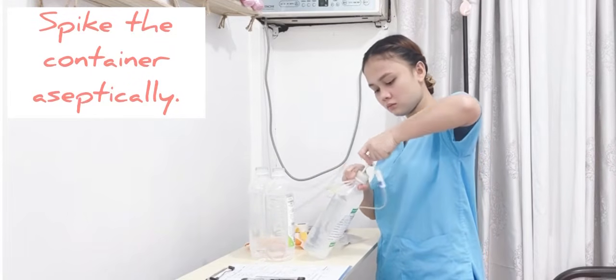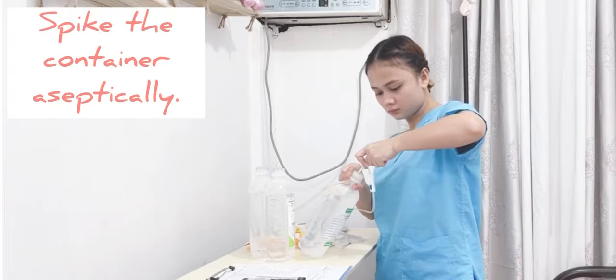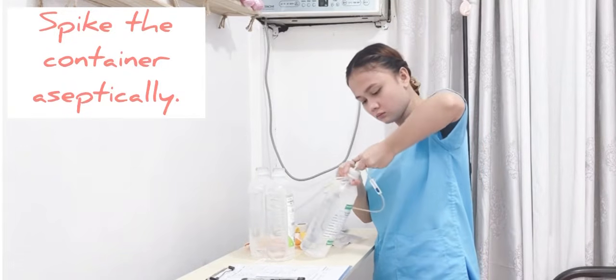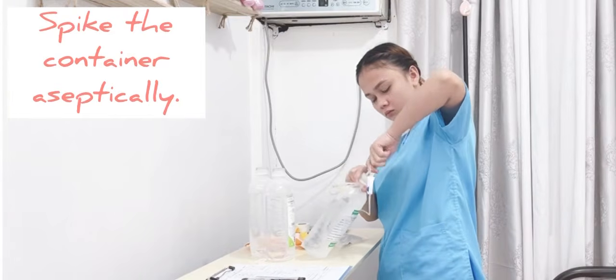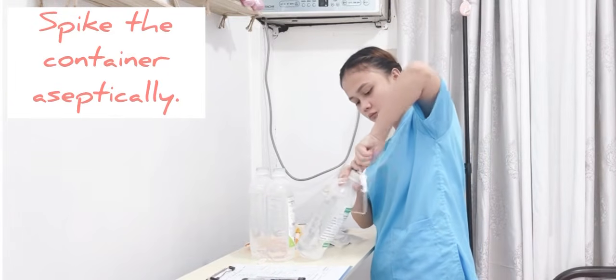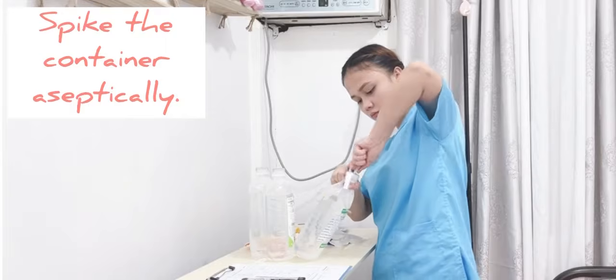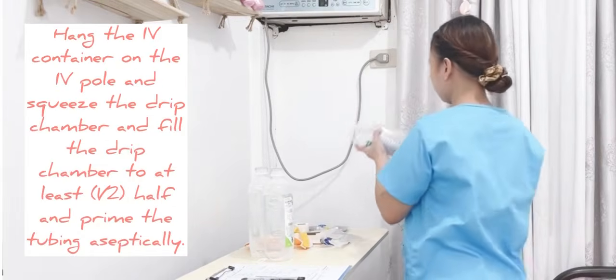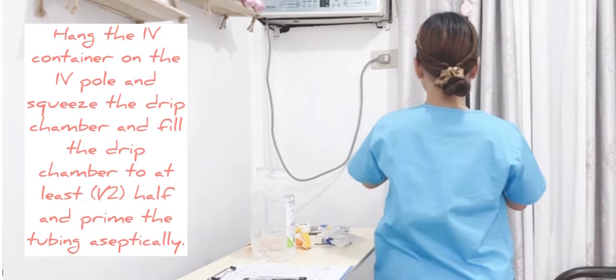Then using a twisting and pushing motion, insert the administration set spike into the entry site of the IV container. Then hang the IV container on the IV pole.